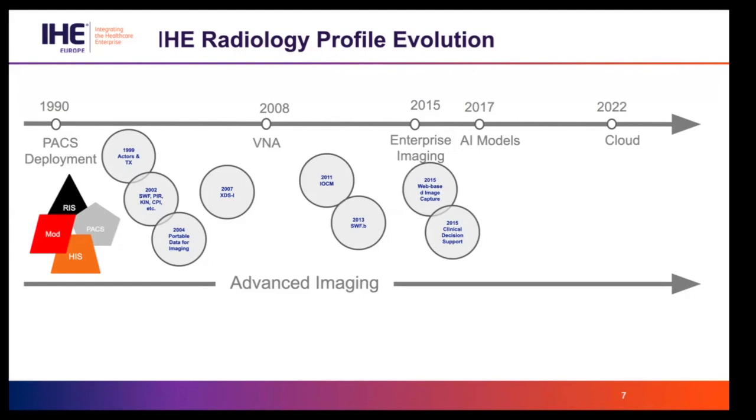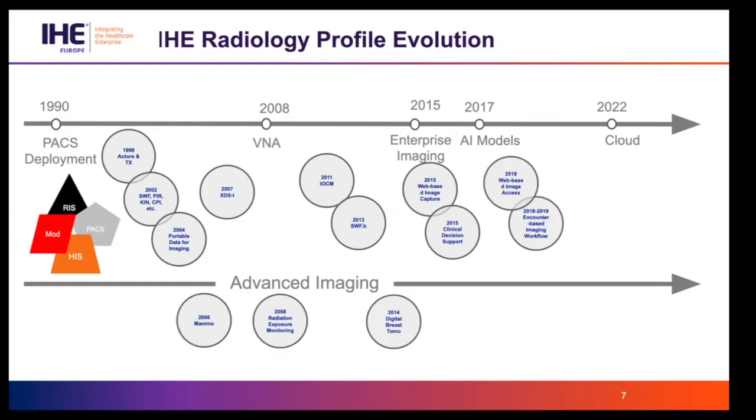Enterprise imaging came along in 2015, and IHE followed suit by introducing more profiles related to some of the interoperability needs in that area, which is not nearly complete. And we continued working on that for the following years.